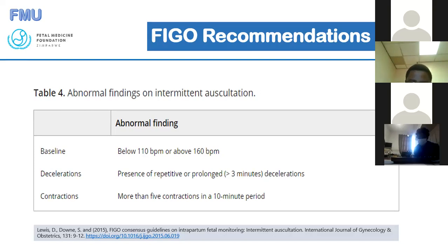All I've seen are tonic contractions where people are saying they are too much. But it's not common to see them recorded, though probably here and there they are. So all I'm saying is that the intermittent auscultation, where we are monitoring the fetus, still needs to be improved so that it aligns to what is known to work rather than what we are currently doing.